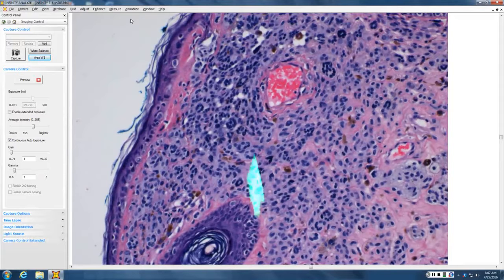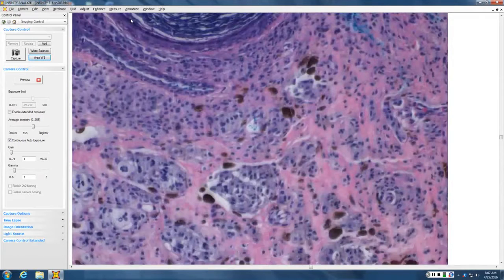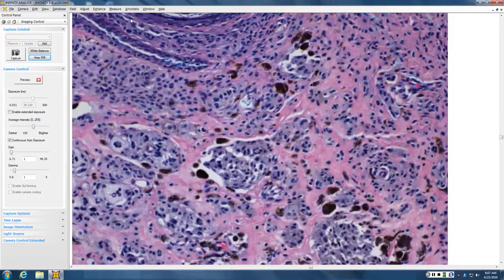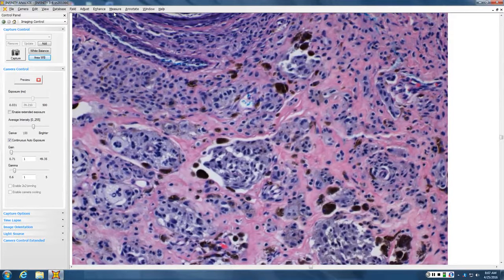So when you have pigment that deep, you're either thinking melanoma or some sort of blue nevus. And what do you think about the nuclei of that central clone that's kind of gray? It looks like a DPN. Yeah, like a deep penetrating nevus. But since there's the junctional component, you probably go combined. You're absolutely right.